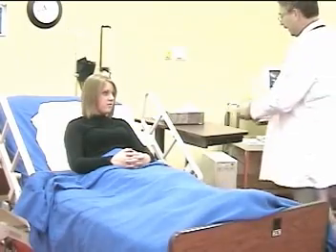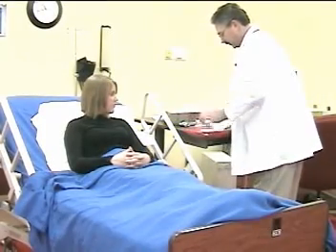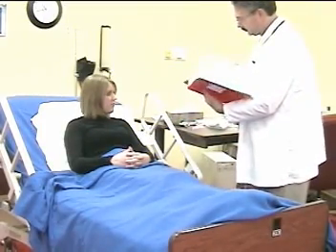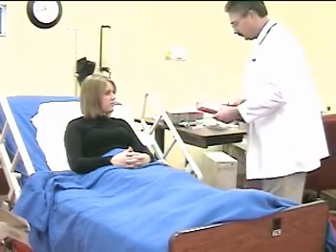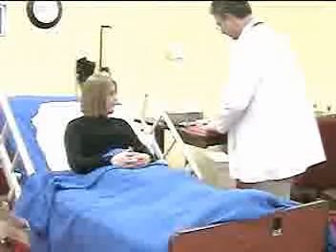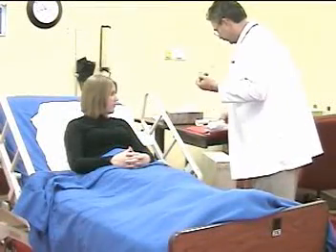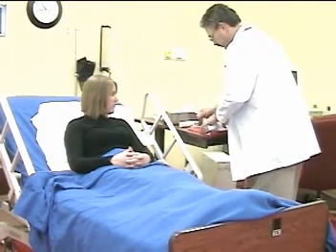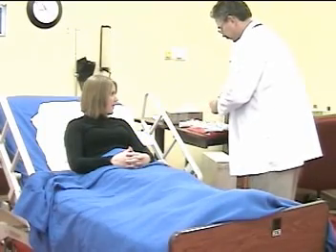Small Volume Nebulizer Therapy: The therapist verifies the physician's order, scans the chart, follows standard precautions including hand washing, checks the patient's ID tag, obtains the required equipment — oxygen flow meter, small volume nebulizer, and peak flow meter — and prepares the medication in accordance with the physician's order.